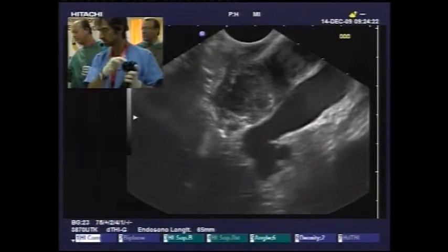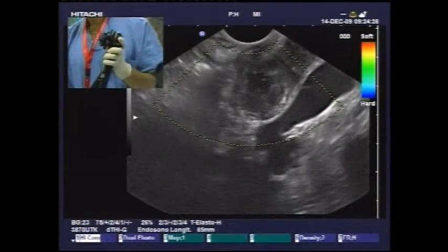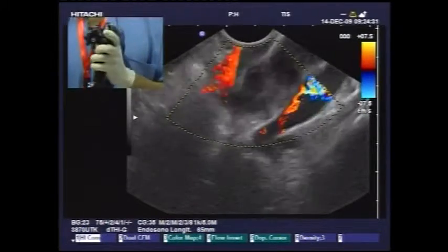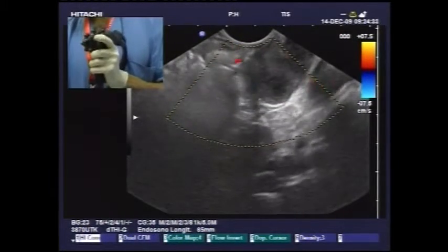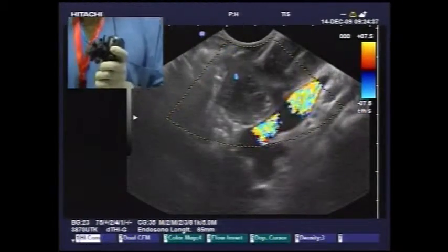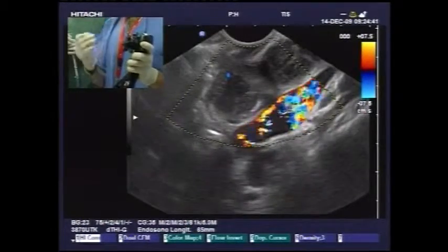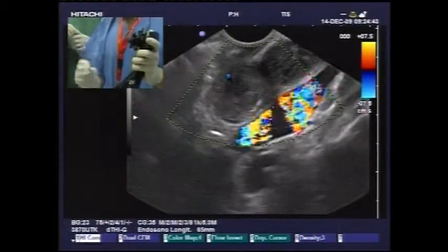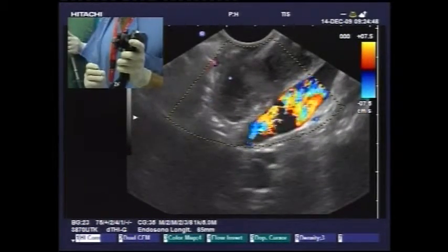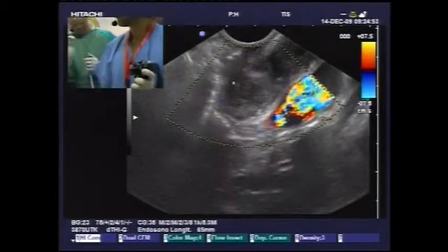Yes, we were just wondering if the macroscopic appearances of the aspirate would be helpful in telling you whether this is a caseating necrotic node or whether this is inflammatory or neoplastic. Yeah, this could be. Sometimes when you do the biopsy, you have caseosis into the core, so you can do the diagnosis only at the first site. So it could be.